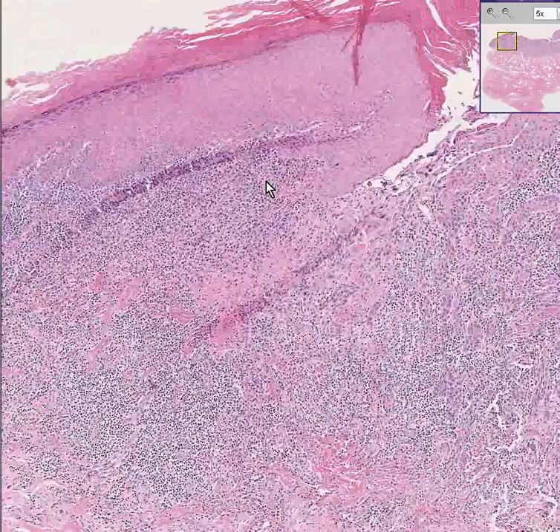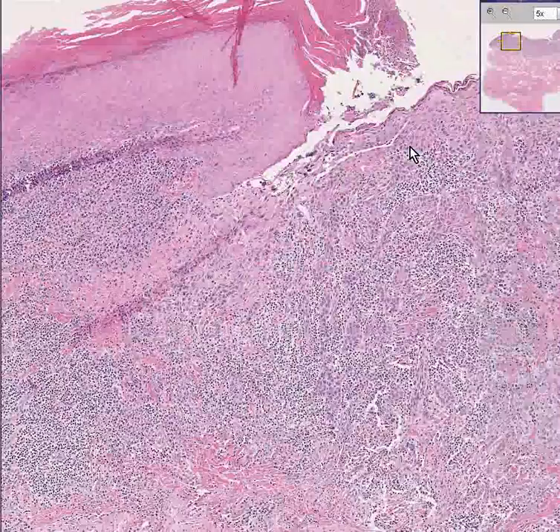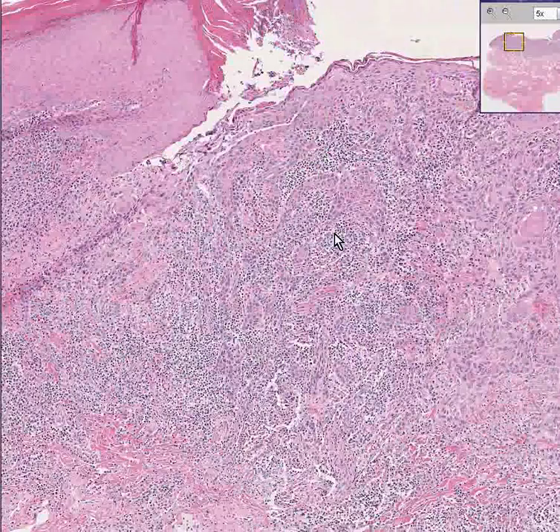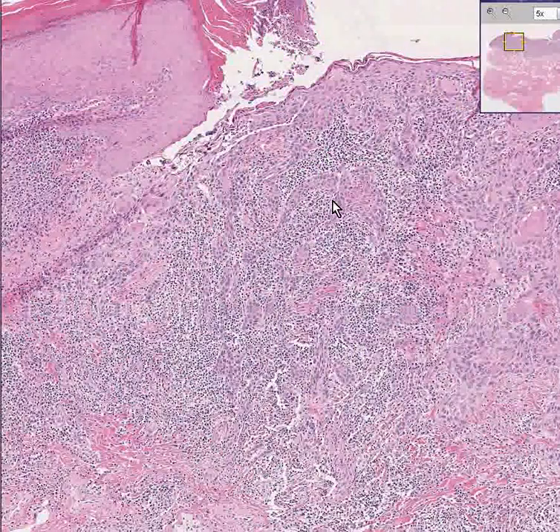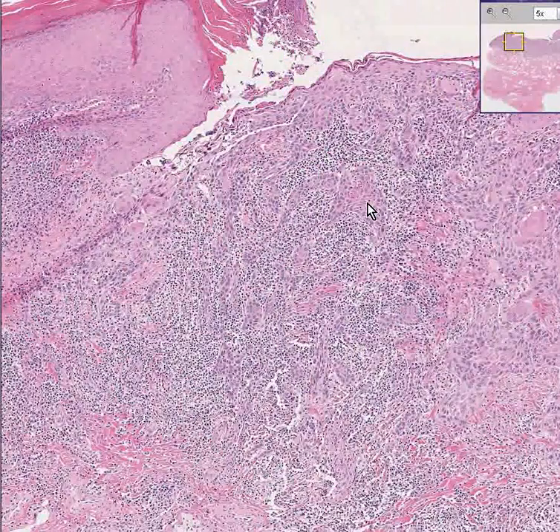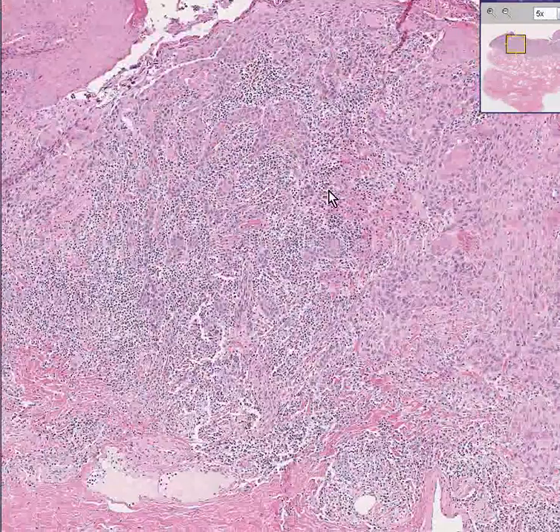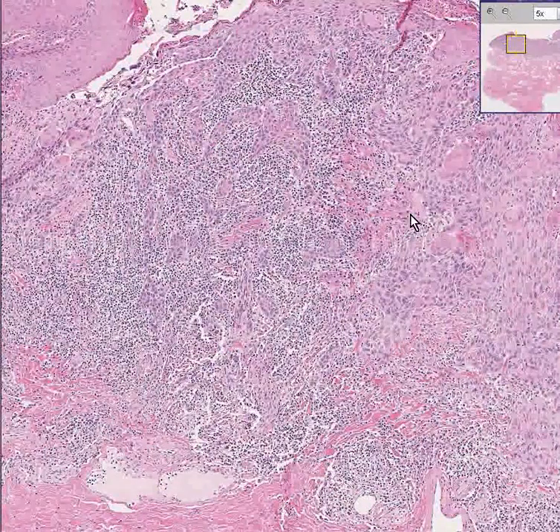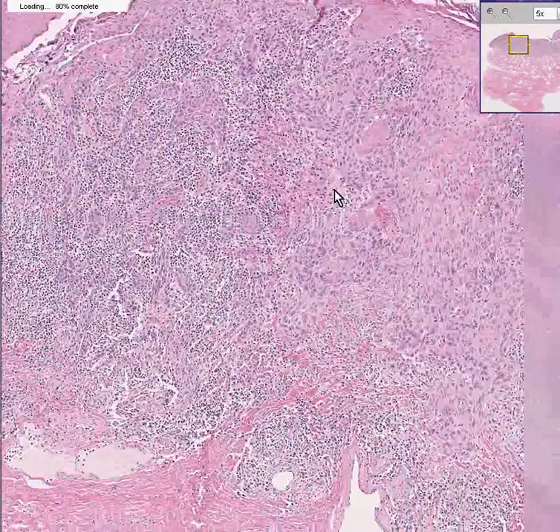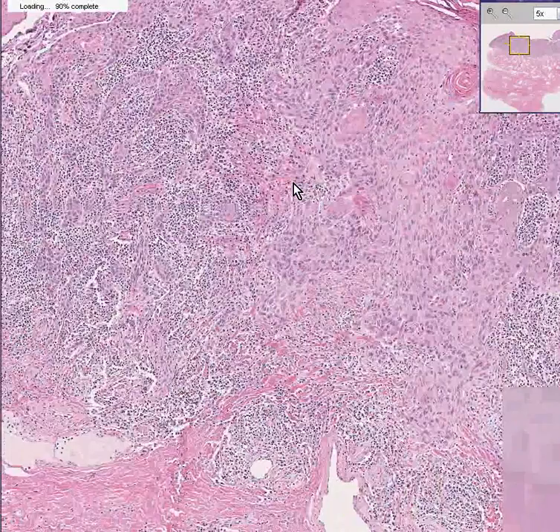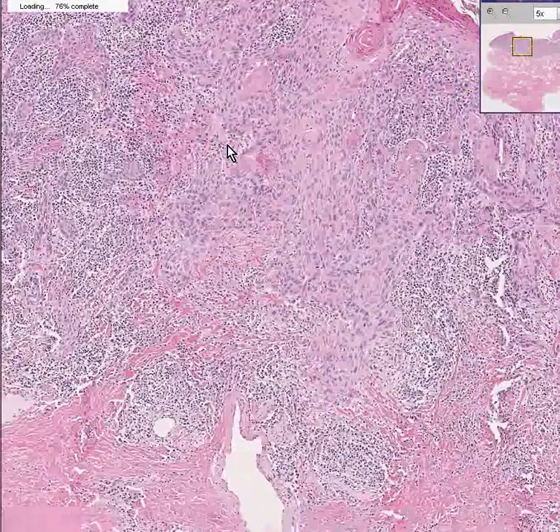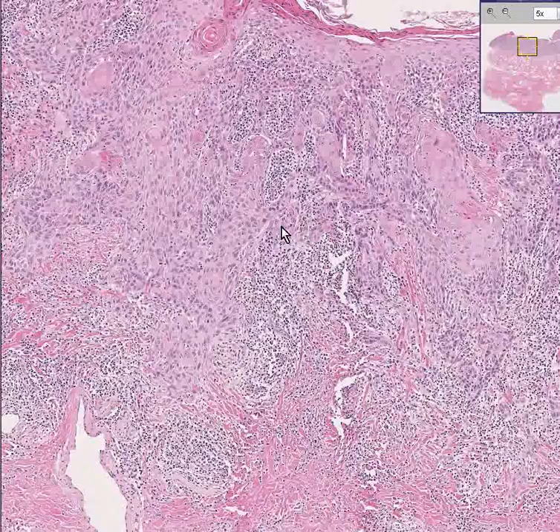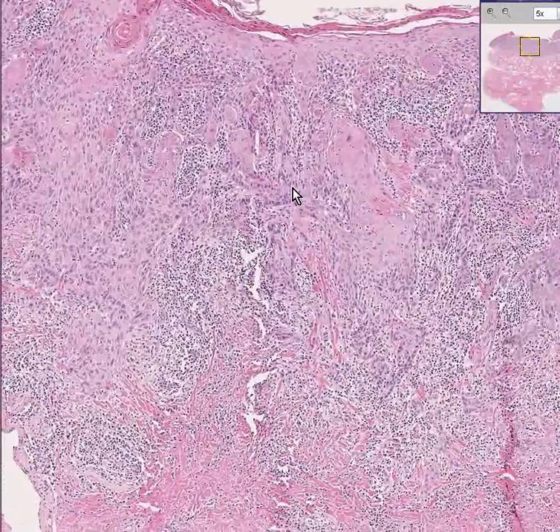But at the edge of the ulcer, you could start to see these little infiltrating squamous epithelial nests. Even at this stage, you know this has to be infiltrating squamous cell carcinoma.